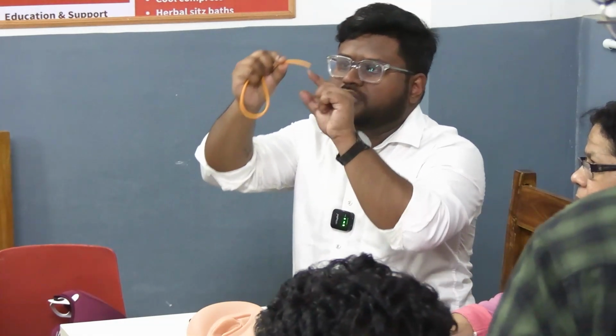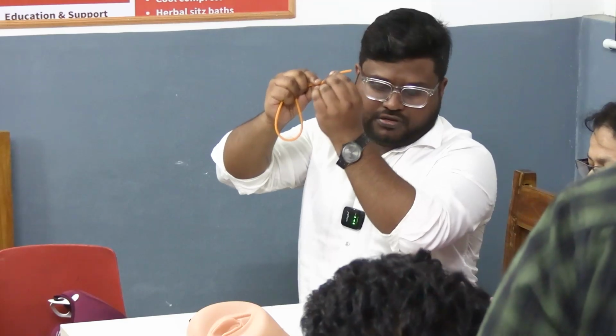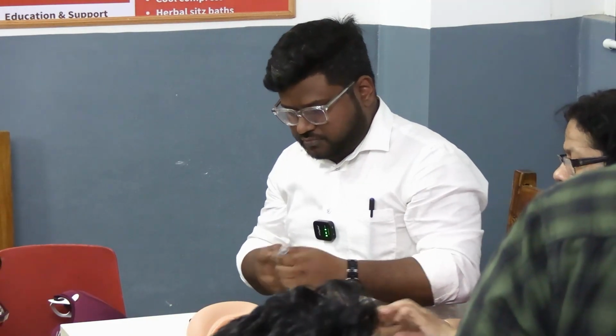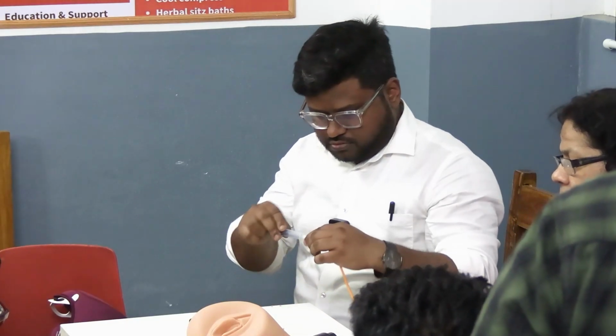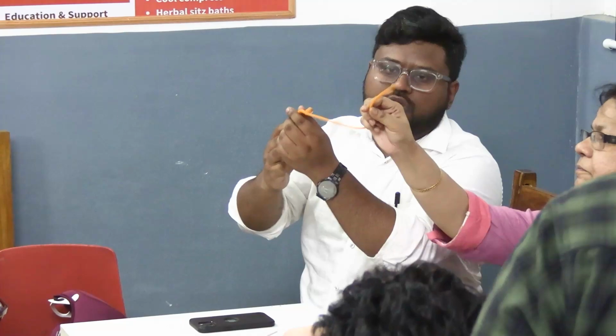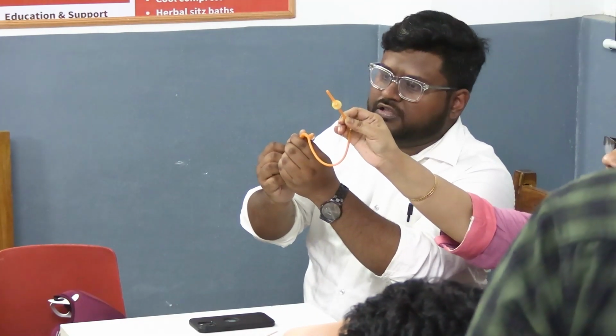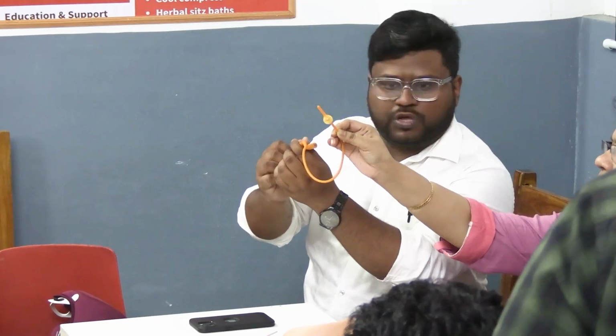This part here, see this part is a little raised. This contains a balloon here. I'm going to inflate it with air. I'll show you something. Let me show you upwards first, to see what happens. See, if I inflate this, the balloon here is inflating. Can you see?